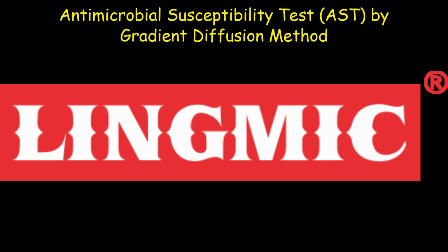In this video, we will demonstrate the gradient diffusion method, a simple and reliable technique to determine the minimum inhibitory concentration, that is MIC of antimicrobial agents in a microbiology laboratory.